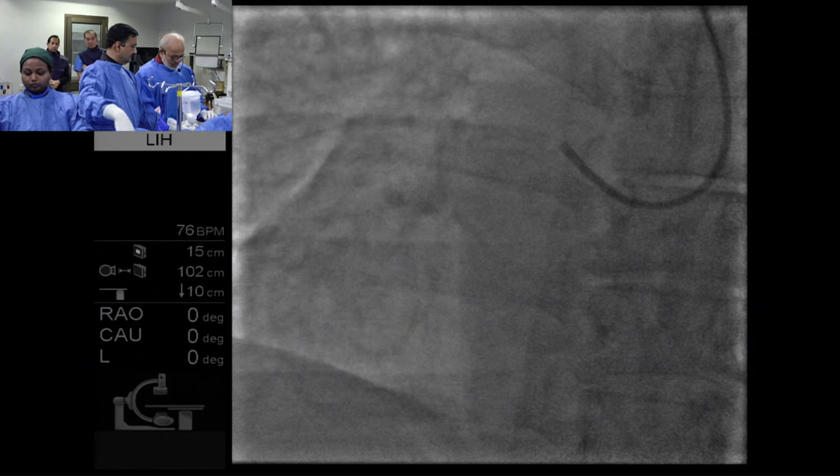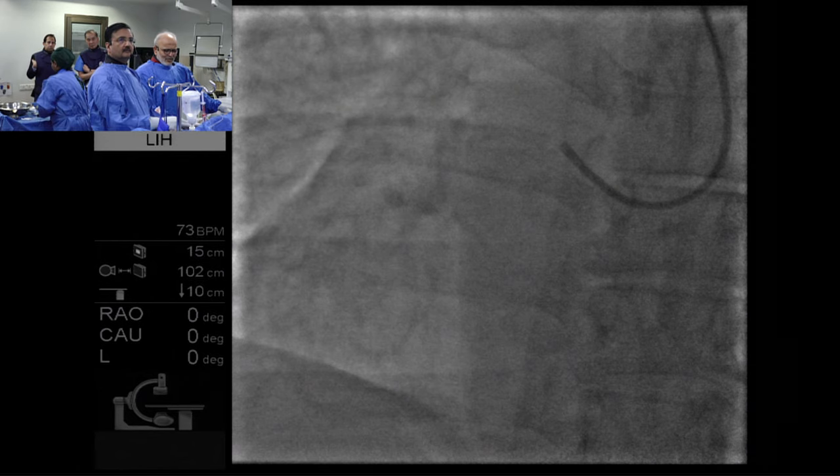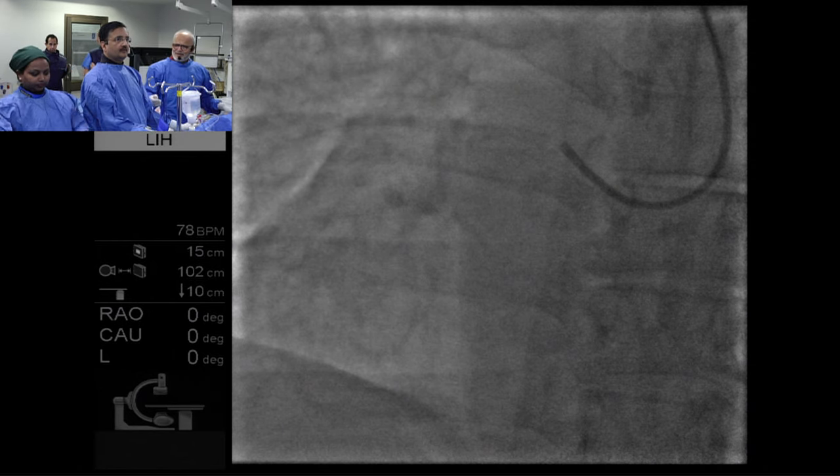Okay, fine. Tejas, out. This is Khalid, a very nice case and very unusual. Khalid, would you consider rotational atherectomy here? I don't mind, but this is a big LAD. And again, something I have learned from Professor Akasaka, that for better MSA in this case, I will use lithotripsy. For me, there are still some great indications for rotational atherectomy. If I cannot crack this lesion with the balloon, then I will rotablate and then again put lithotripsy. Otherwise, if the lithotripsy balloon goes in, no problem.